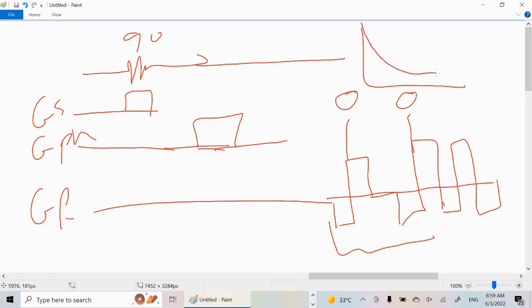So when it goes down like this, what are you doing? No, you are doing rewinding, meaning this gradient is rewinding the protons. So instead of the curve being like this, you made it like this. With each peak, you capture an image. However, if this exceeds a certain limit, it can cause significant signal loss and introduce artifacts. This is one of the very fast examinations with many applications.